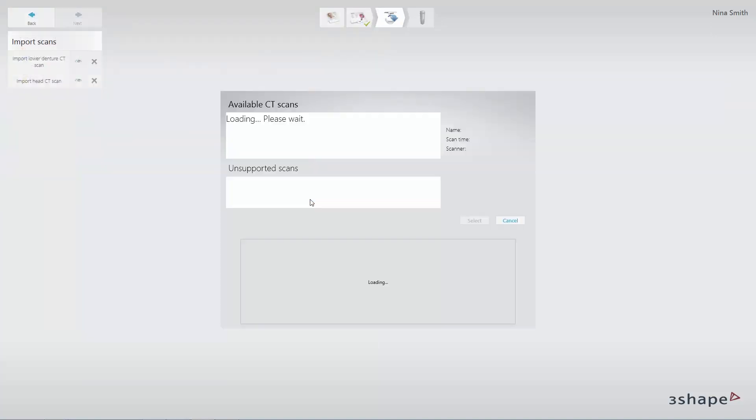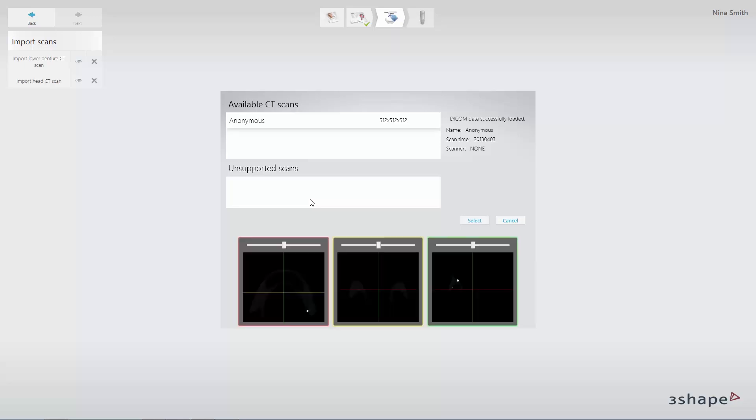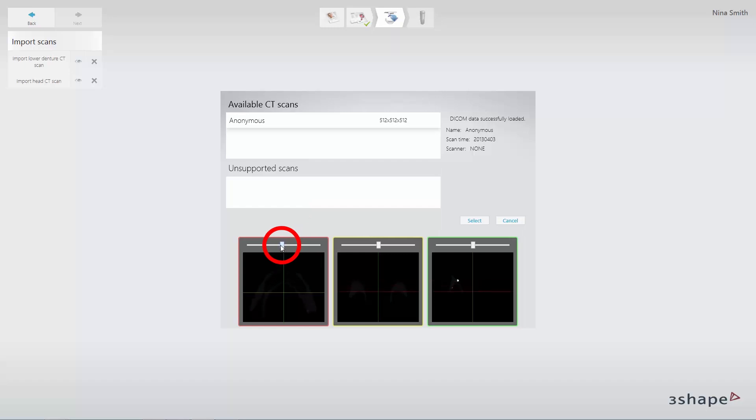The CT scan preview will appear. You can preview the CT scan in the different views. Click Select to finalize the loading of the scan.